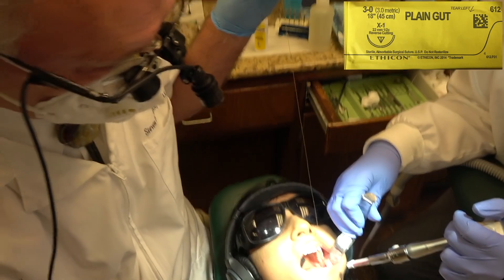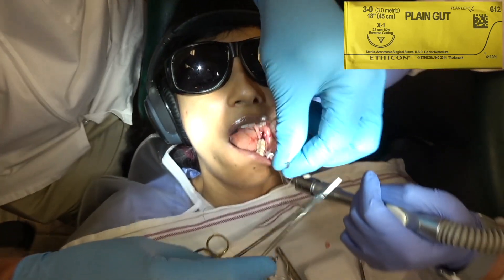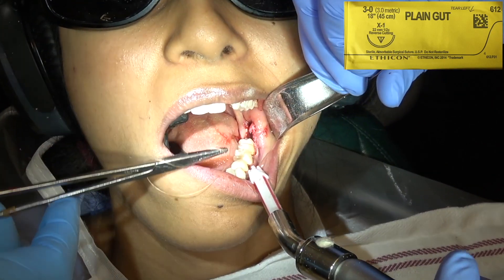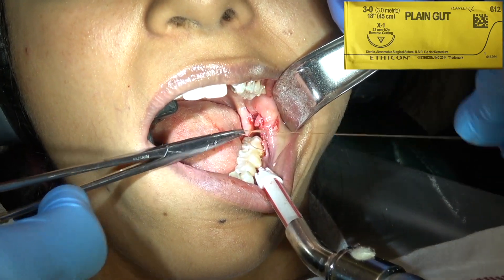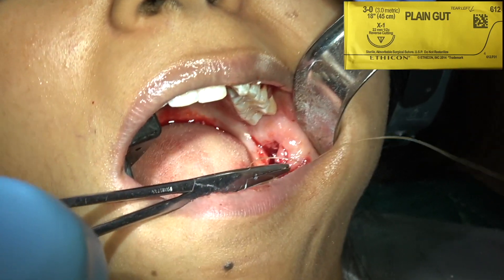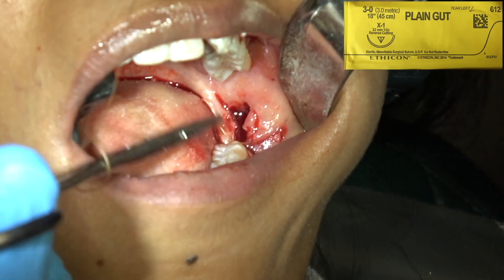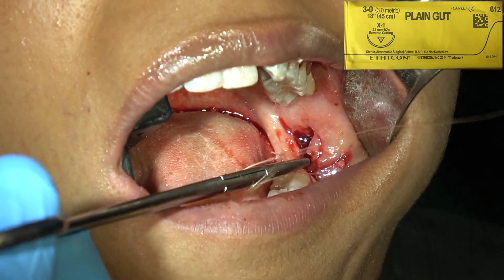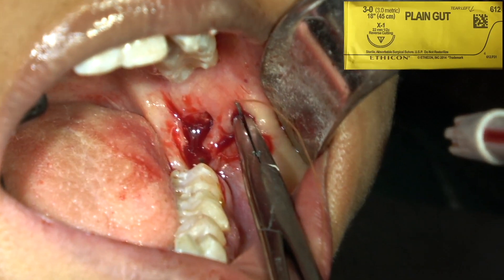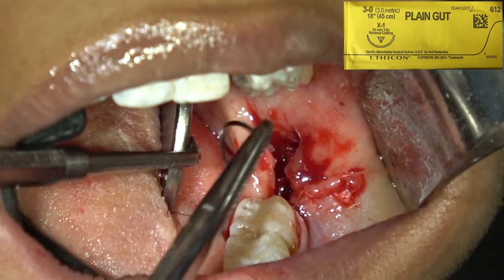For a mandibular extraction I place either 2 or 3 sutures. The suturing technique is very important: wrap three times away from you and pull, then wrap one time toward you and pull, then one time away from you again and pull. If you do 3 wraps on the first throw, the suture won't come loose. If you just do 2, it'll probably loosen up and won't be as snug.